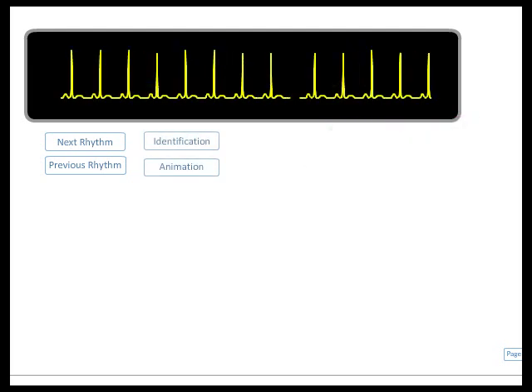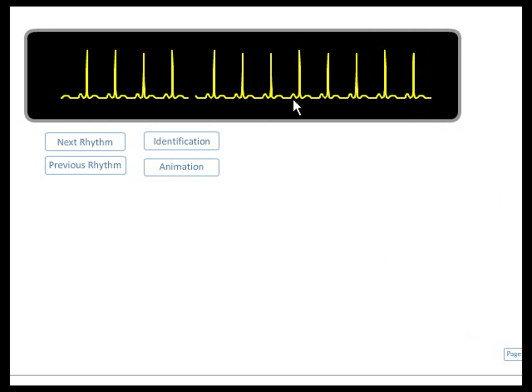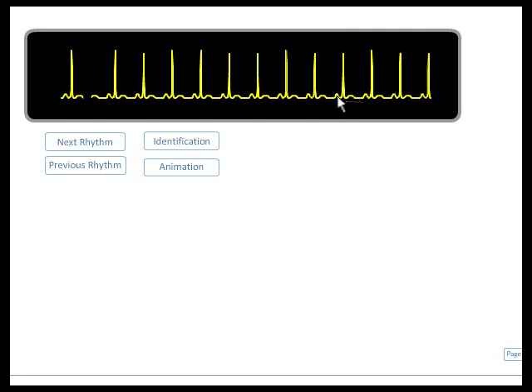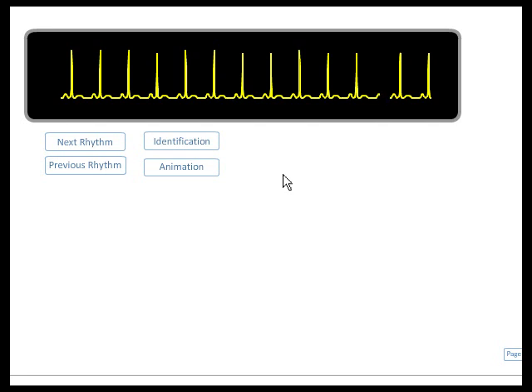In this slide, we have a regular rhythm with a P wave in front of every QRS. The PR interval is constant with normal width, and the QRS is narrow. The rate is about 130 to 140.